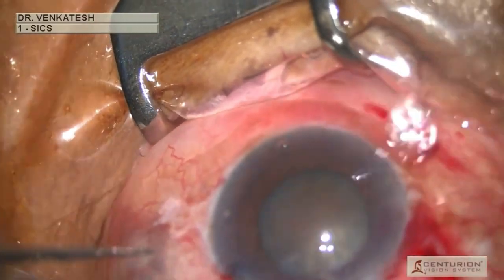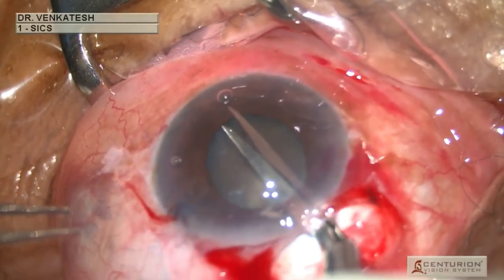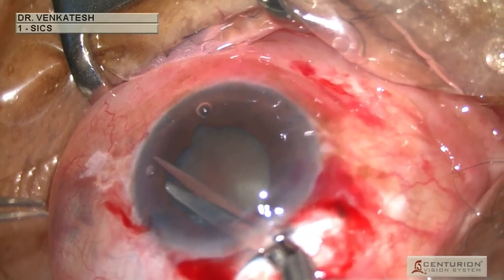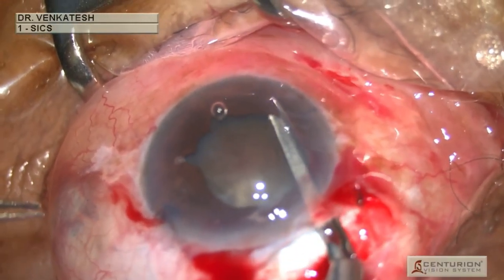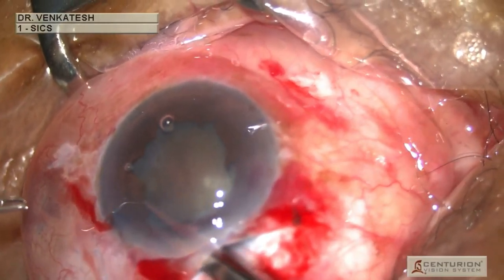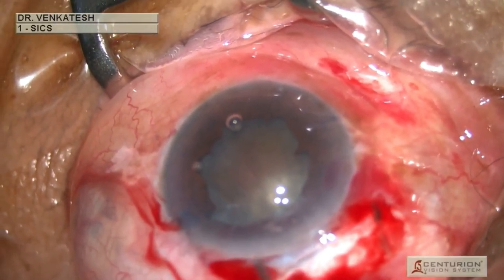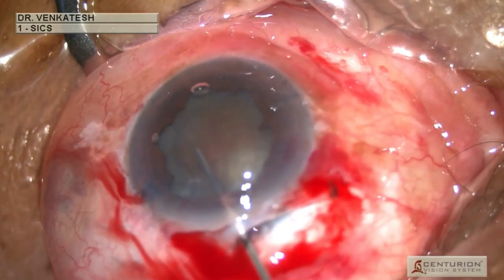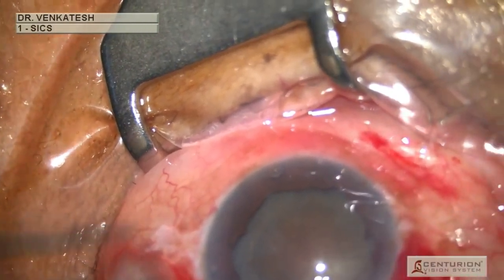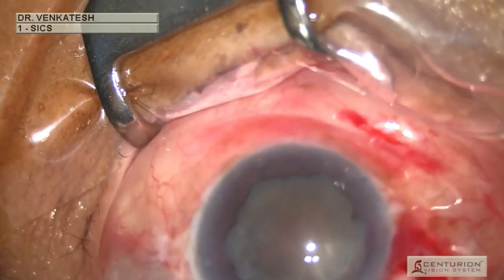Multiple sphincterotomies were planned due to the pupillary size. The cuts are made at the six o'clock position, the 4:30 position, the 7:30 position, the 9:30 position, and the 2 o'clock position, creating a pentagon-shaped large pupil. It is very important to space the cuts as evenly as possible to provide a uniform shape, and to avoid large iris tags as they can get sucked into the Simcoe cannula.